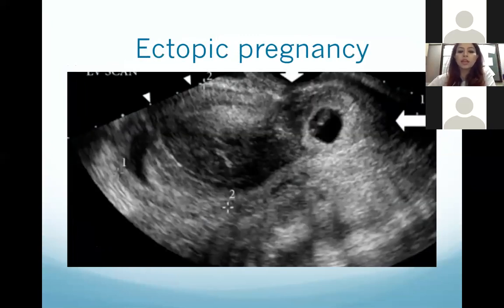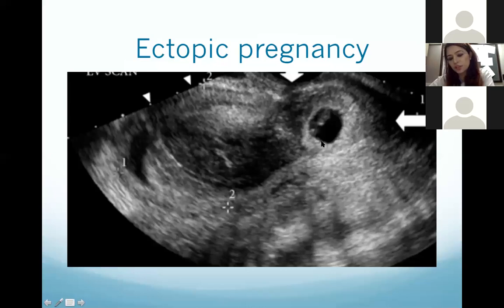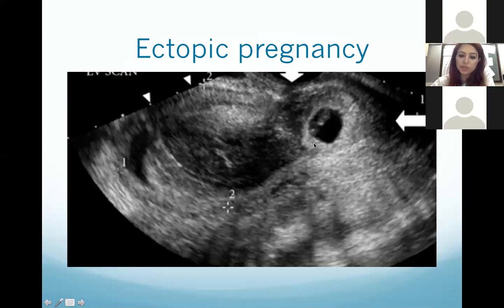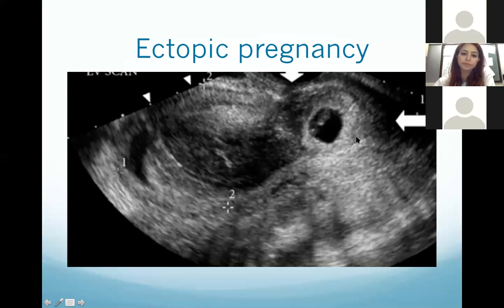This case shows an ectopic pregnancy. This is the uterus; outside the uterus you can see a ring-shaped structure with a small yolk sac and fetal pole in it — this is the ectopic pregnancy. Ectopic pregnancy can be tubal, ovarian, or within the broad ligament. Cases with a thick ring around the gestational sac are usually tubal, representing the edematous tube walls around the gestational sac.